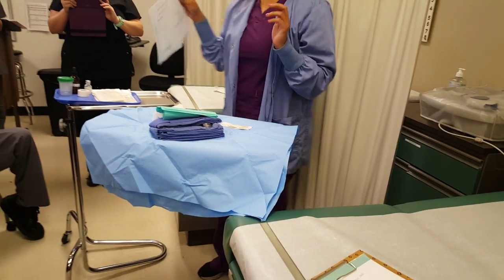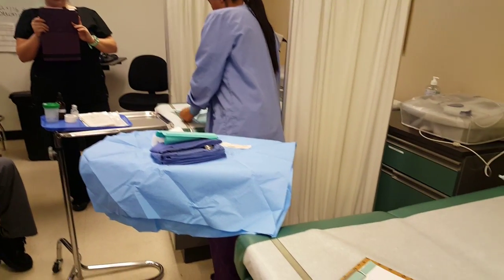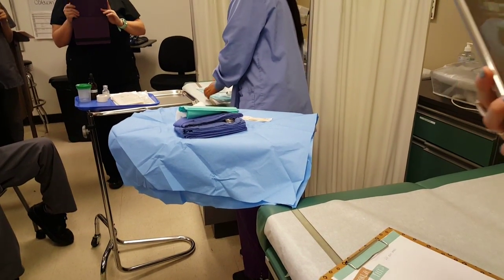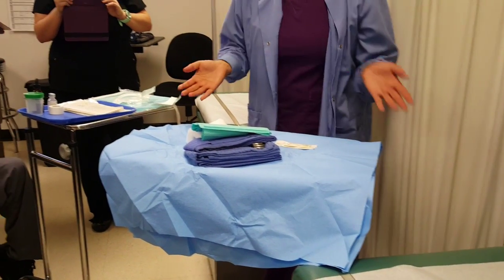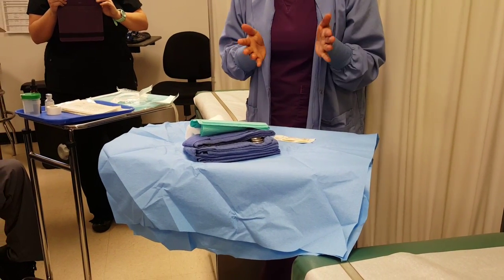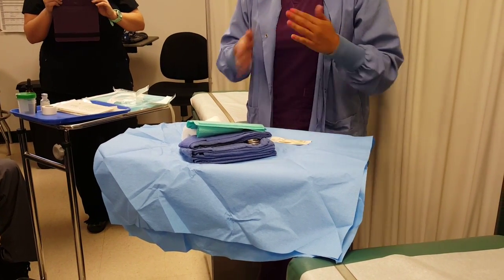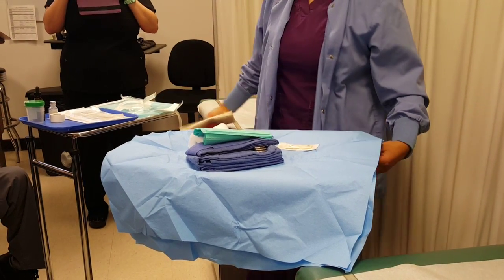I've dropped all my items onto the tray. Keep your packages so we don't have to waste. Now I have to go in and organize everything, because my doctor isn't going to come to this mess — I have to fix it so he knows everything is in order. Let me set this aside for a minute while I get my sterile gloves.